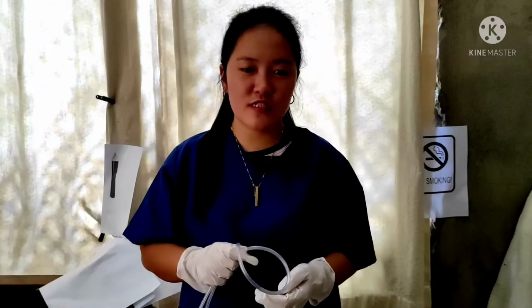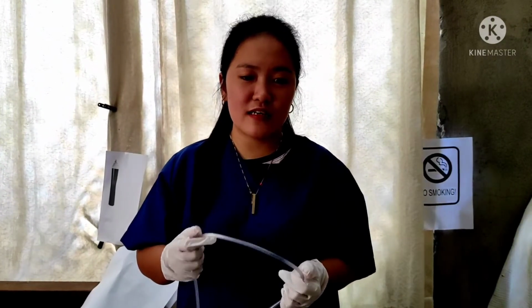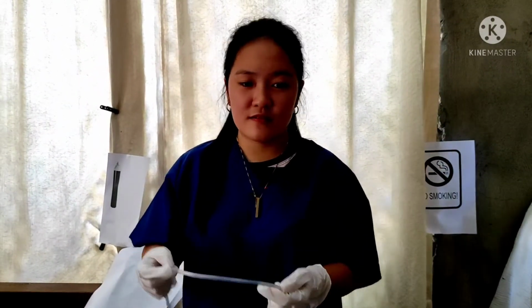Adjust the flow meter setting to the ordered flow rate. The flow rate via the cannula should not exceed 6 liters per minute. Higher rates may cause excess drying of nasal mucosa. Insert the nasal cannula into the client's nostril.